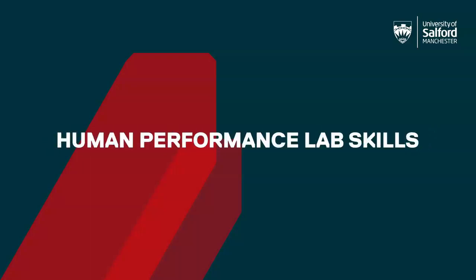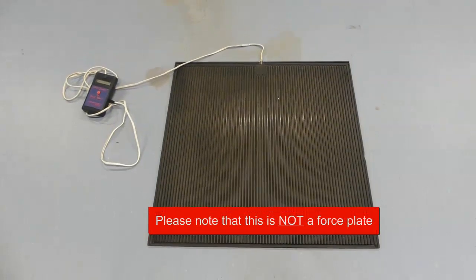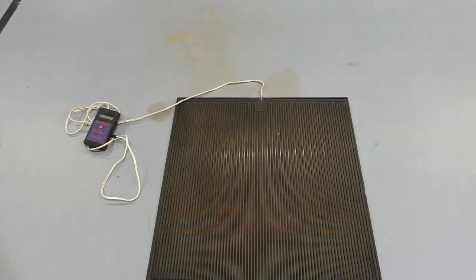In this video we are going to look at how to use the JustJump system, which can be used to find jump height. The JustJump system is a contact mat in which microswitches embedded within the contact mat detect flight time. From the flight time, jump height is calculated, and we will look at this a little later in the video.